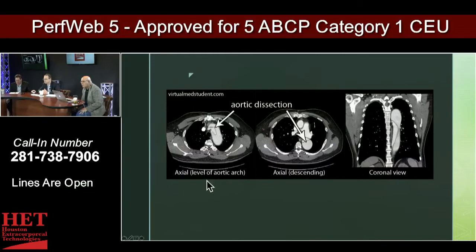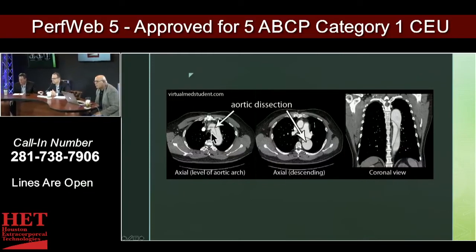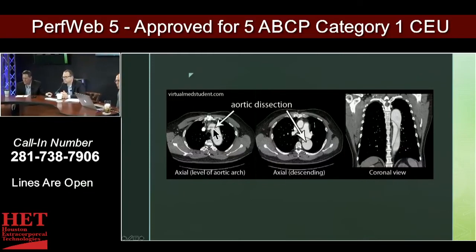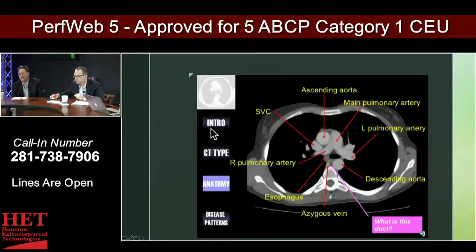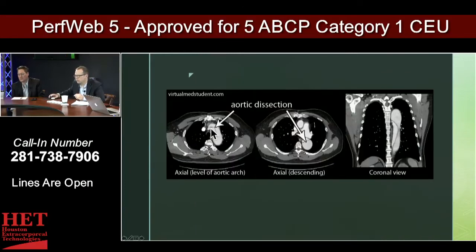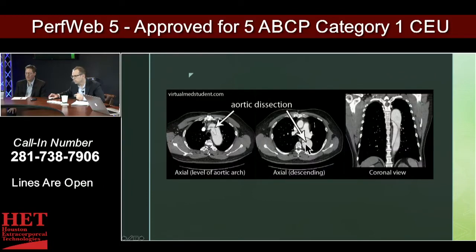That pointer is at the beginning of the dissection — whether or not it's the very origin I can't tell without looking at the whole scan, but it certainly goes into the ascending through the arch. This is demonstrating it in the arch of the aorta, and this is it extending into the descending thoracic aorta.